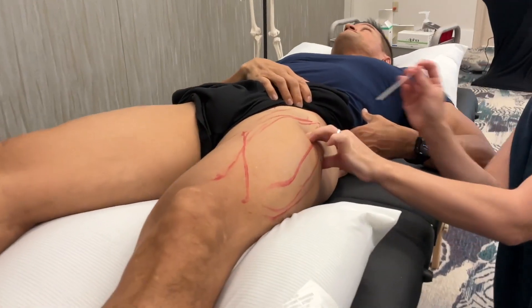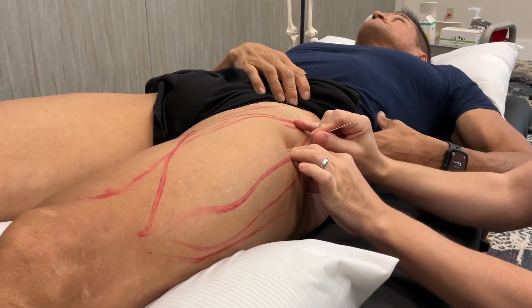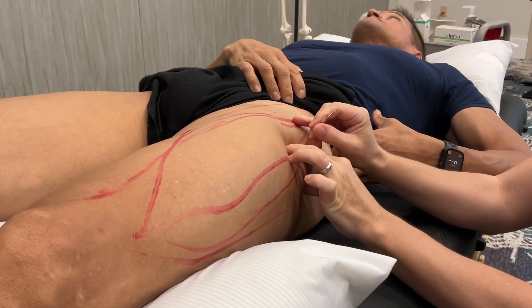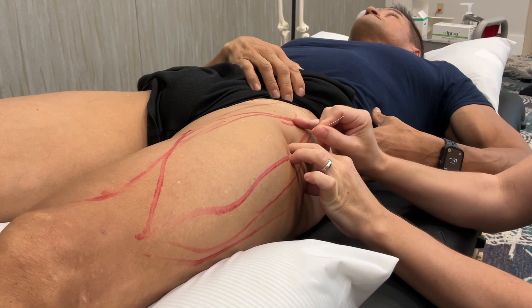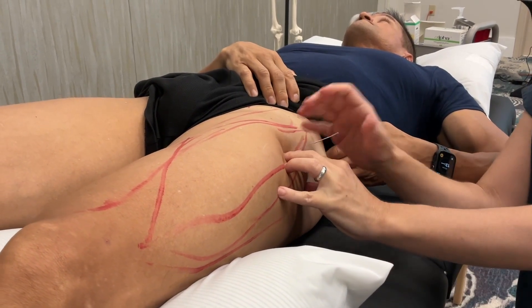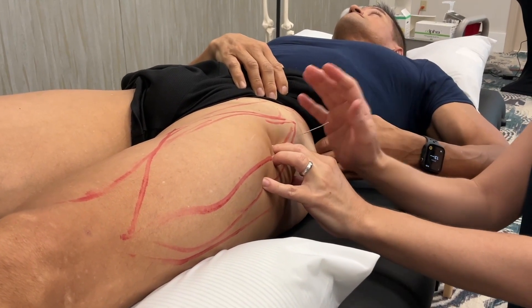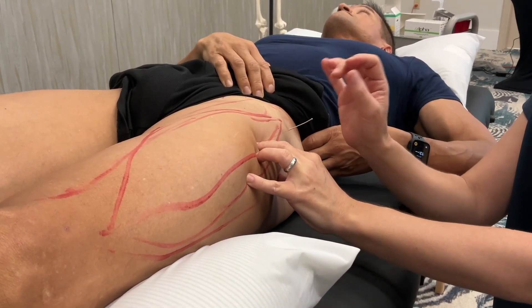Here's one right here — see me move it. Now we're going to do a quick insertion. I like to do even pistoning, nice in and out.